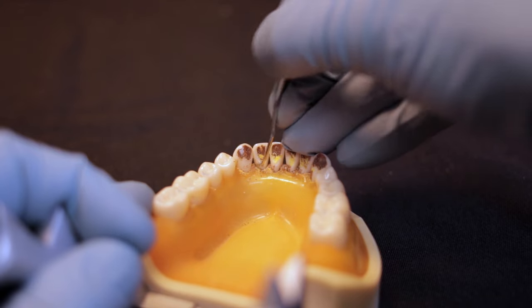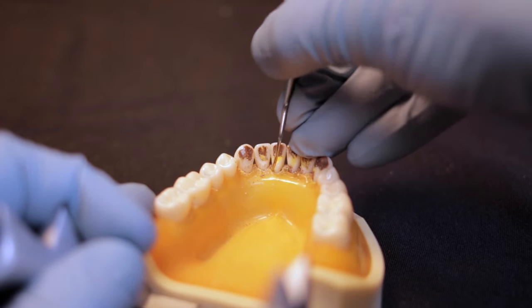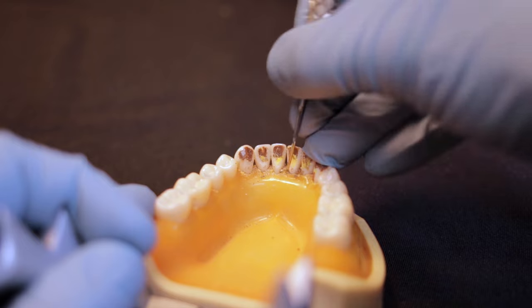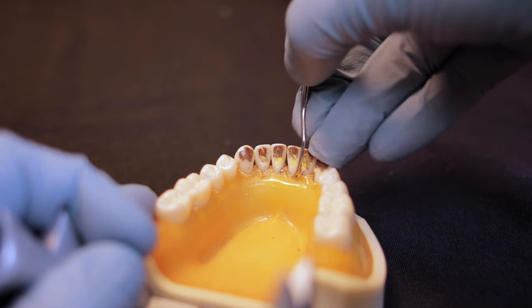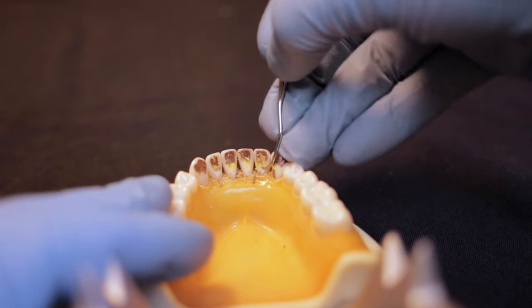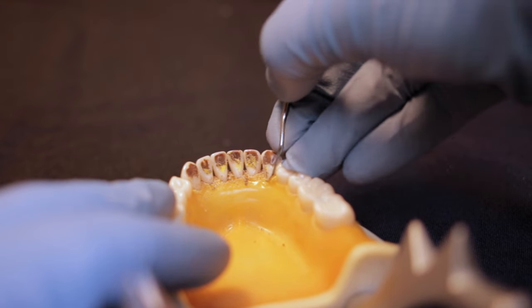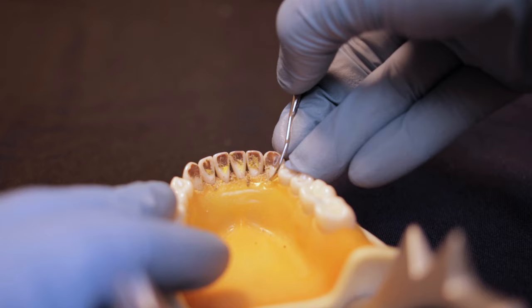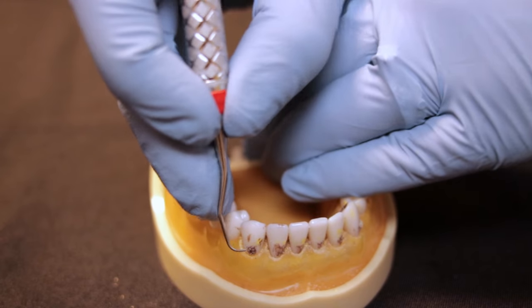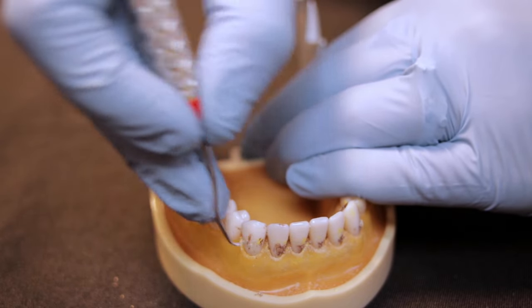These are really tiny teeth so this tends to be tricky for students — use only the very last millimeter or two of the instrument. This is the best instrument for going sub-gingival because the curette only has one cutting edge. You can go sub-gingival with the sickle, but the tissue has to really allow it; for someone with healthy gingival tissue that won't be easy. I always like to go sub-gingival in the anterior with an area-specific curette, cleaning up those straight lingual surfaces.